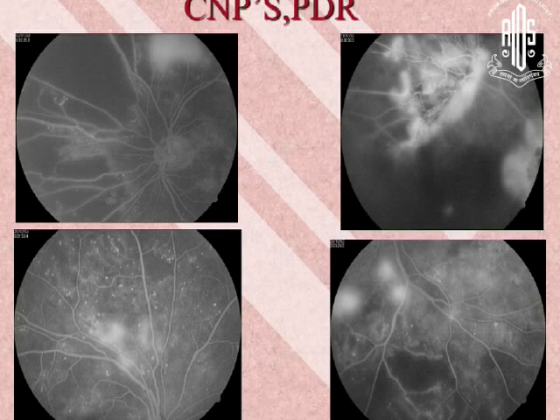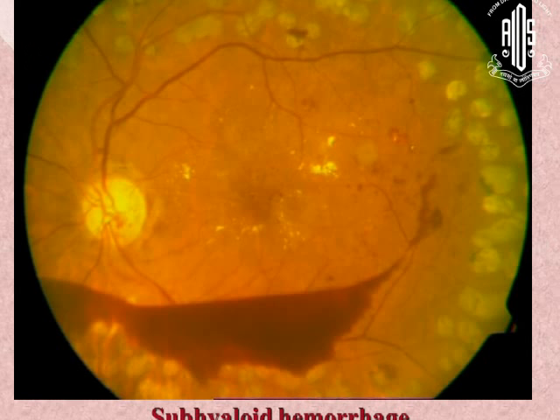So sometimes we see massive capillary non-perfusion areas, which suggests that there is an increased VEGF activity there, and that it would be prudent to do a laser even if there are no neovascular elsewhere. So, coming to an example of blocked fluorescence in diabetic retinopathy, if you see a subhyaloid hemorrhage or a vitreous hemorrhage, that will cause a blocked fluorescence.